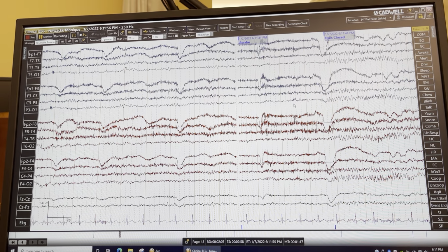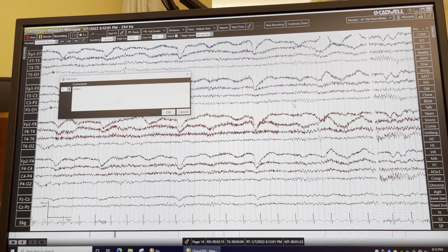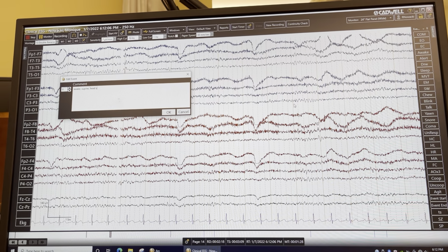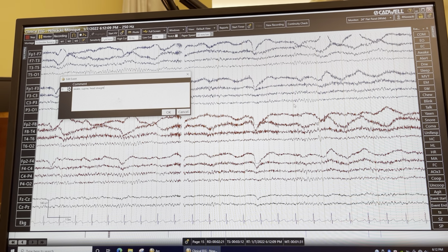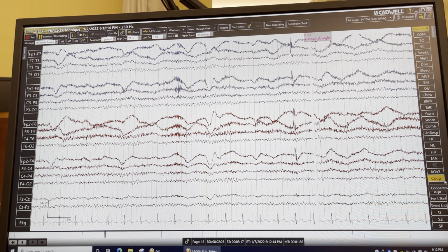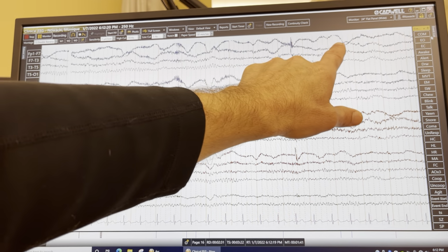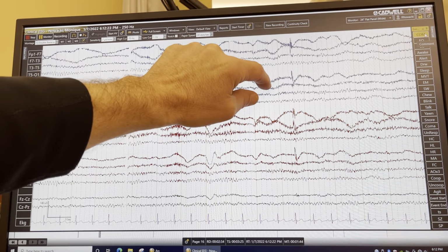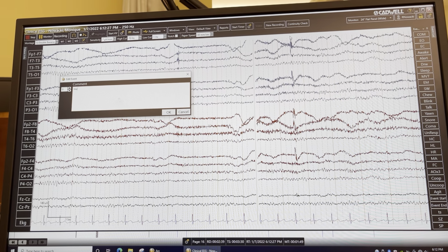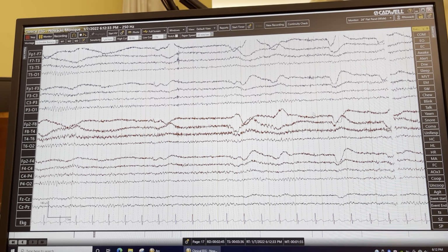And you can just start typing. So on the screen, right? Awake, supine, head, head straight. So if you just start typing, it'll just do it that way too. And yeah, if you want to place a comment on the screen in a very specific spot, let's say there's a muscle jerk right there. So we'll click on comment, put it right there, and then we'll put muscle jerk. Okay, and then it'll put it right where I had it.